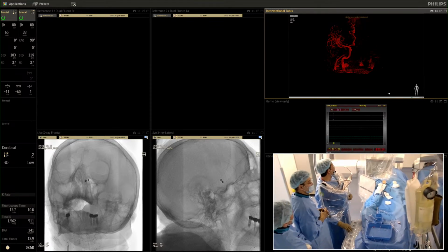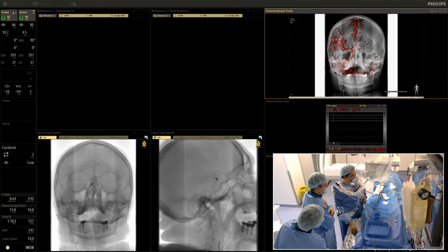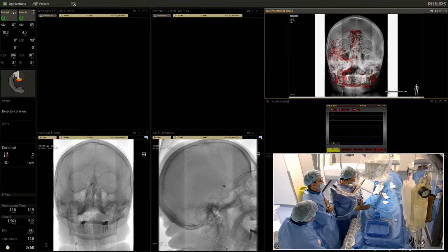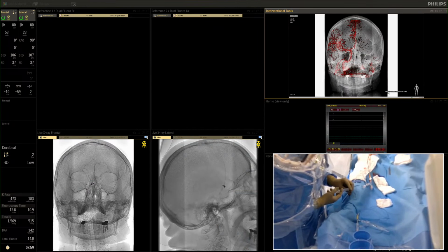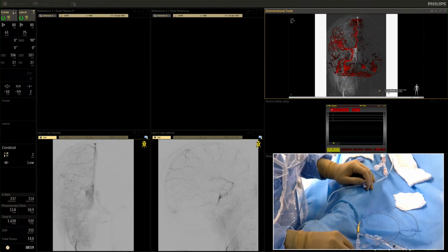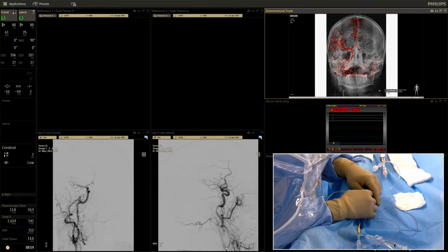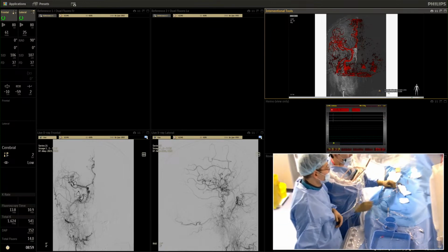The blood aspiration is a very important point of every procedure because we create spasm, and the most common complications of these operations are thromboembolism, and hijama, so-called endovascular hijama, is a technique preventing those thrombotic complications. Yes, there is a spasm, but it's okay. There is no dissection, it's just a spasm. And we can go for the left side and check and finish.